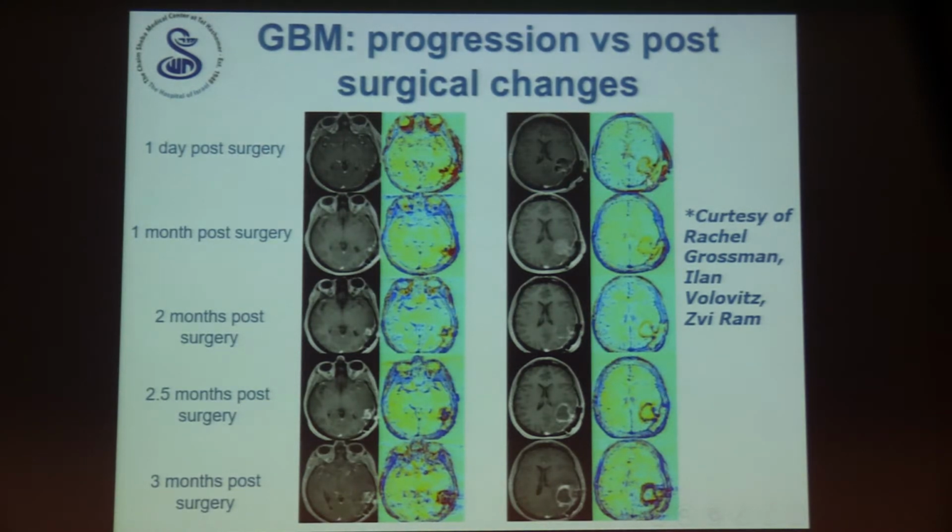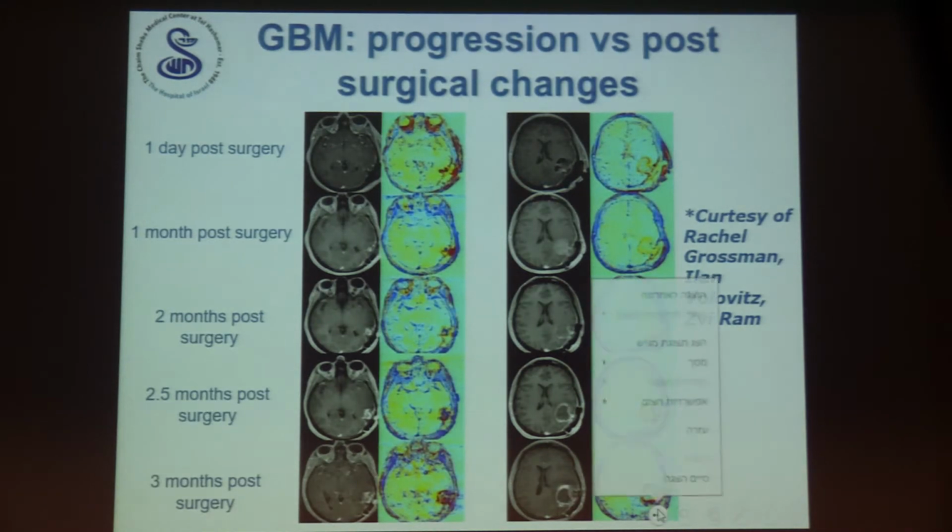But in this case, on the other hand, I don't think we saw anything in the first day. We saw like these 2 blue dots a month later, which is again the standard time, and then that grew into being tumor.